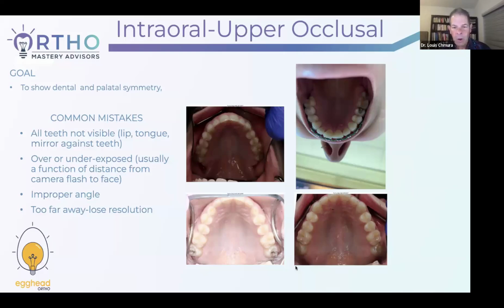Okay. Now, are they horrible? Well, no, they're not horrible. But is this one you're going to put on your wall, showing before and after, where you see the front teeth are crooked, and then on the last part, you don't see the front teeth at all? And people are going to say, oh, he didn't show the front teeth because you never got those straight. That's not what you want.